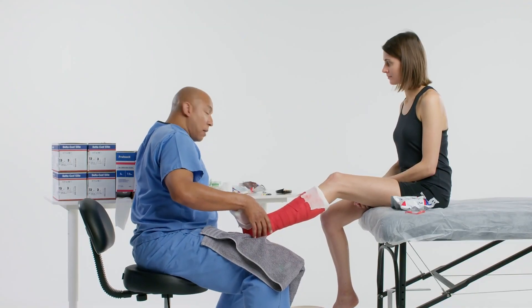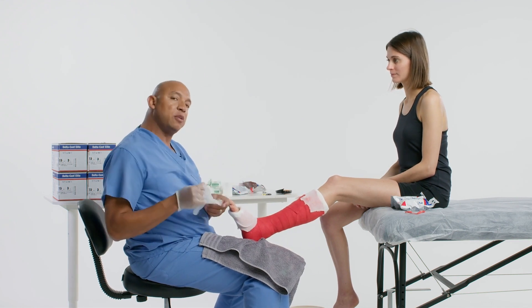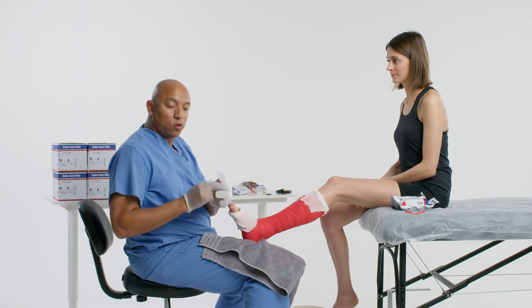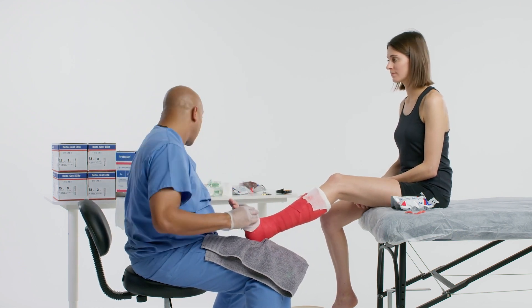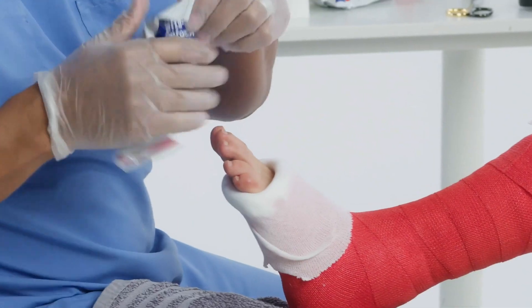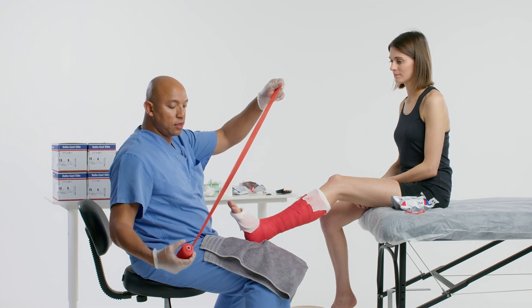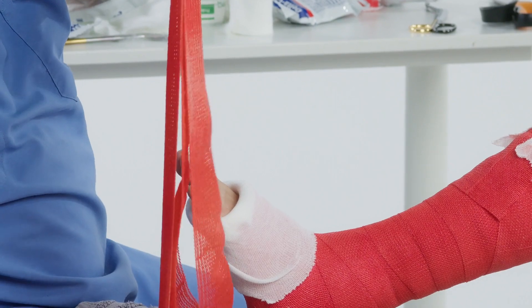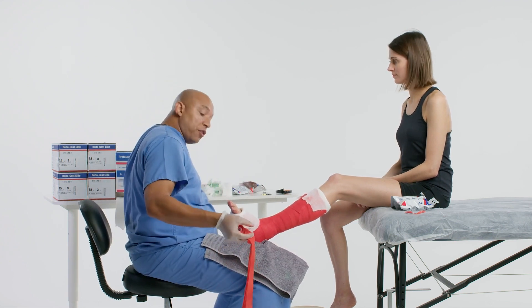Now let's continue with a reinforcement layer. We can make the cast a lot stronger because the patient needs to be resting with their foot higher than their heart. Sometimes they put it on hard surfaces and crack the heel, or try to quickly get to the bathroom without wearing a cast shoe, and they'll crack the cast and have to come in earlier than needed. To add a reinforcement layer, simply get a roll of cast tape and fan-fold it into three layers. The reinforcement strength will be on the posterior aspect without being totally circumferential, so it won't be extra thick throughout the whole cast, making it harder for the clinician to take off.